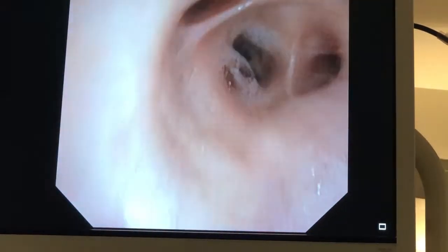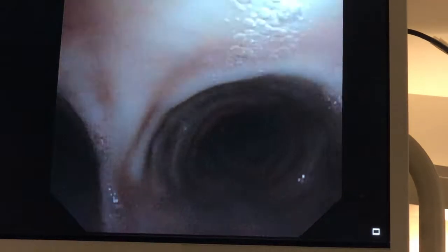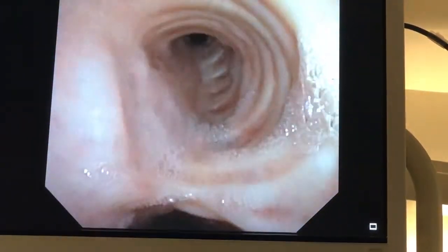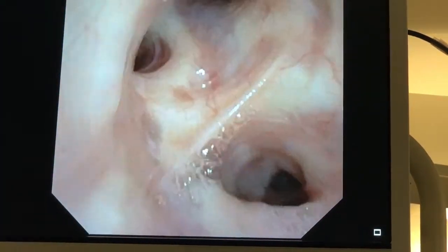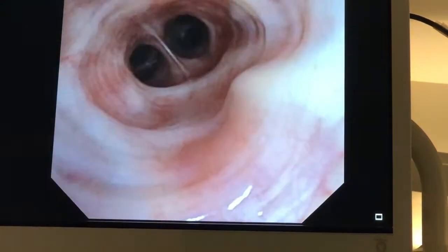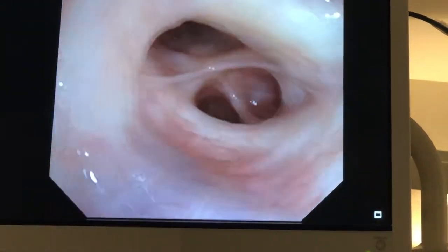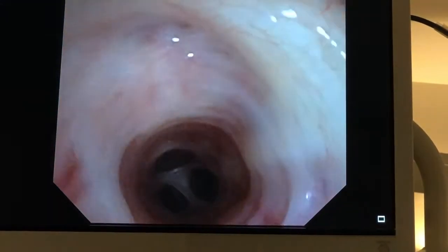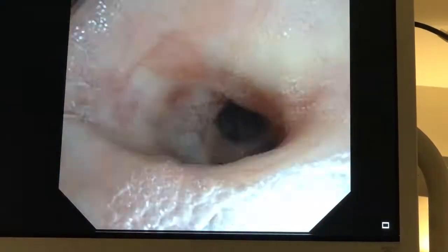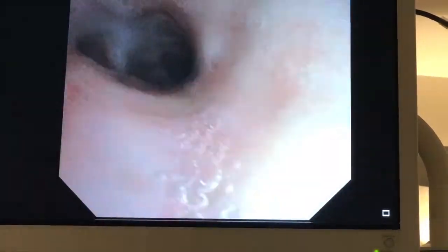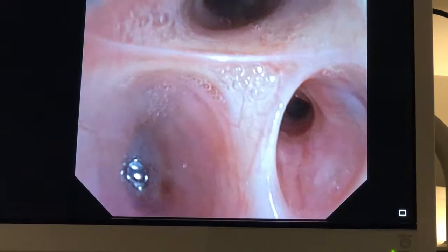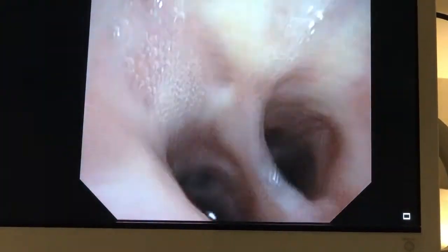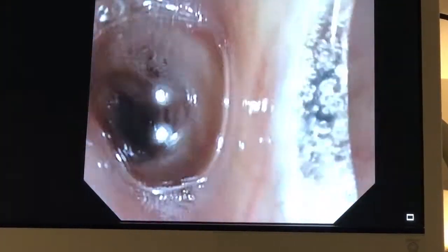Let's have a quick look into the lower lobe to make sure we're not going to miss anything else. Quickly across to the left lung. There's the left main bronchus, left upper lobe, into the apical segment and the posterior segment and anterior segment and the lingula. A quick look into the lower lobe — apical segment and now the basal segments of the lower lobe — and they all look clear.